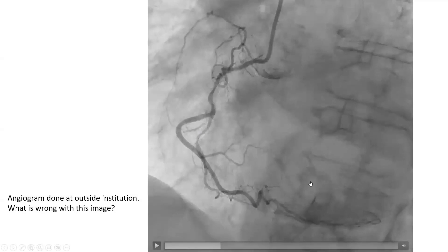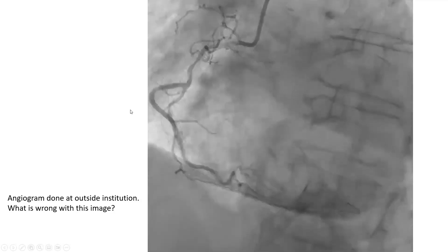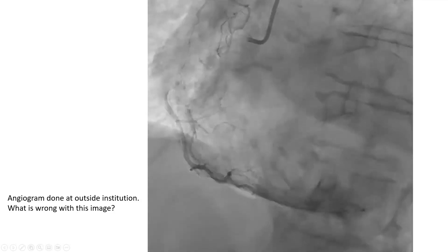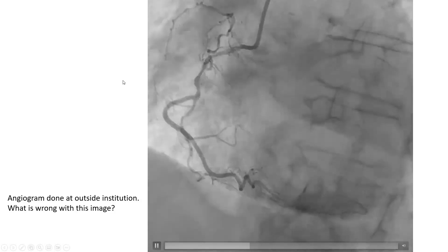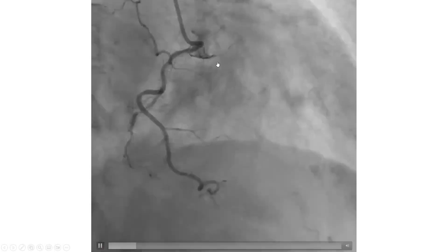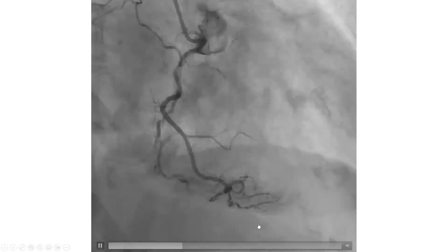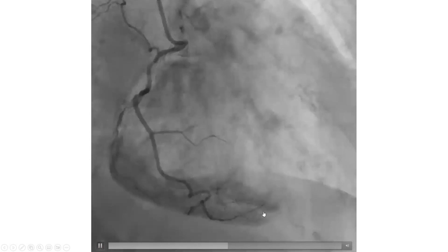This is an emergency. When you see that angiogram, the immediate reaction is to pull out that catheter. They didn't have the right reaction because they kept taking pictures — and look at that — more myocardial stain.